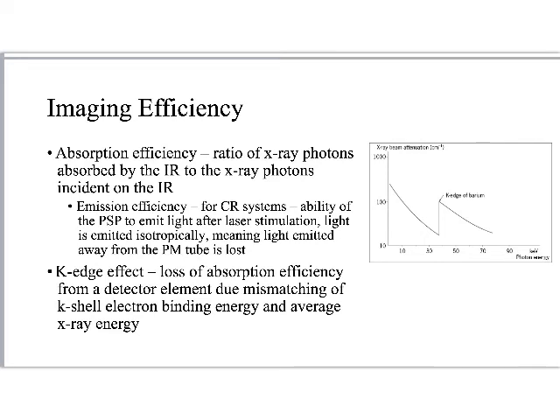Okay, I'm going to change gears now and talk about the K-edge effect, and this is definitely something you want to pay attention to. I'm going way back to physics now, and we're talking about valence shells and binding energy of electrons, right?